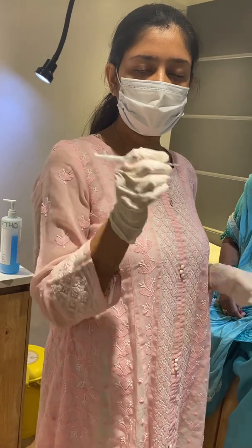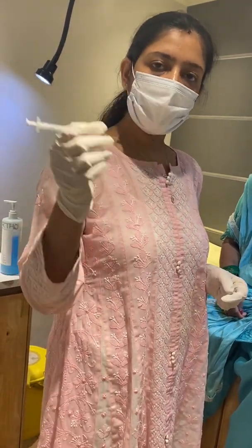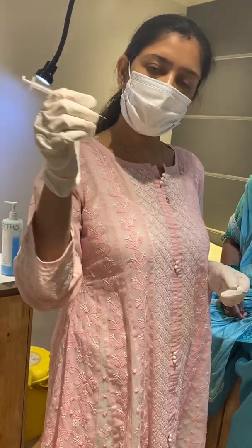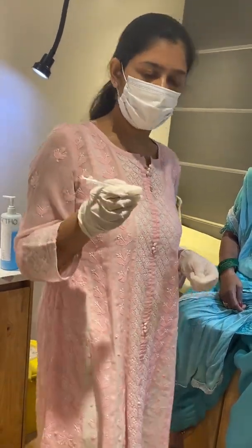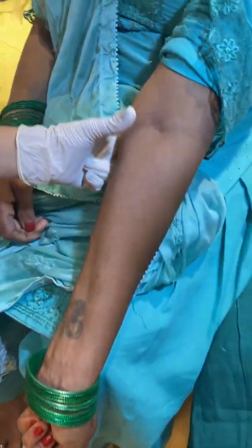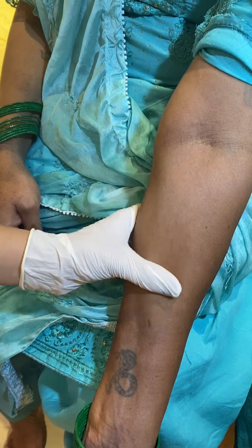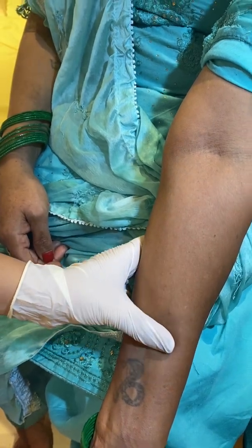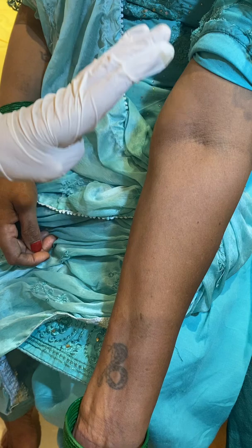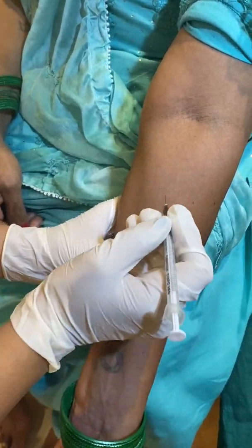We can insert the needle either perpendicularly or in a diagonal fashion at around 45 degrees of angle. It's best to demonstrate the pathergy test on the forearm because the results are better on a hairless area.